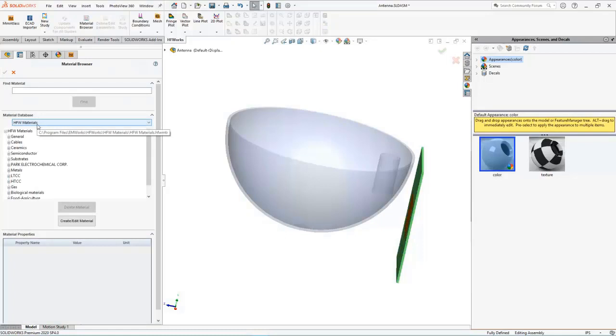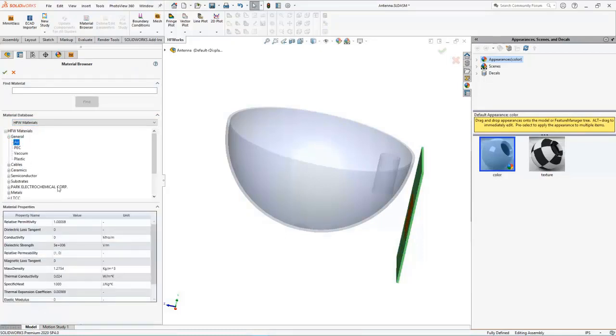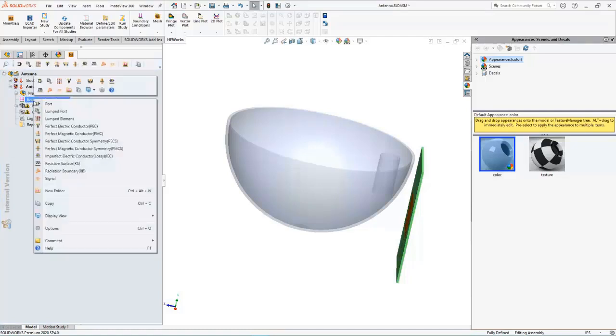HFWorks has an extensive material library. By selecting the material, electrical parameters such as permittivity, permeability, and conductivity will be applied to the body. When the materials are defined, we have to apply the boundary conditions and excitations.